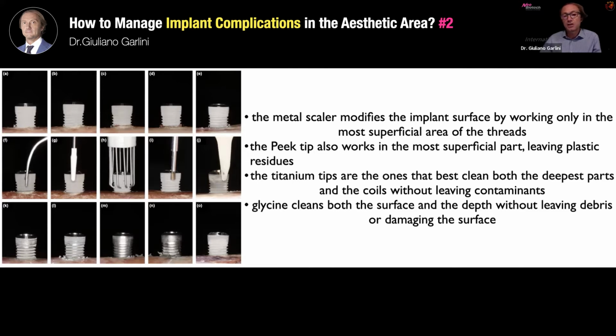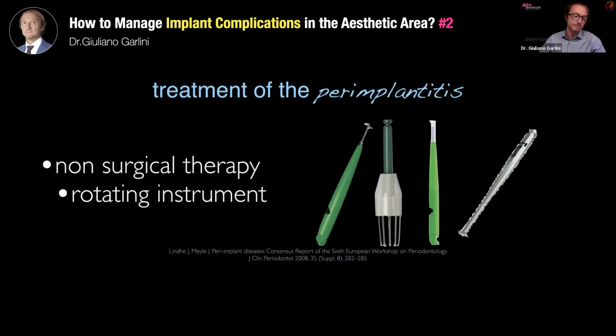So the titanium tips are the ones that are able to clean the implant in the best way without leaving any contamination. And also the use of an antimicrobial agent such as glycine could be considered in this case.